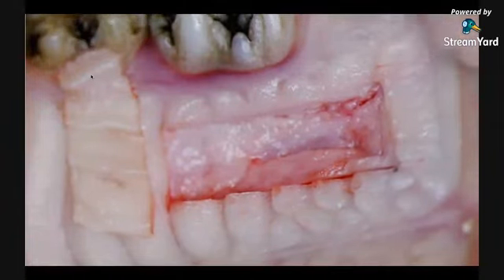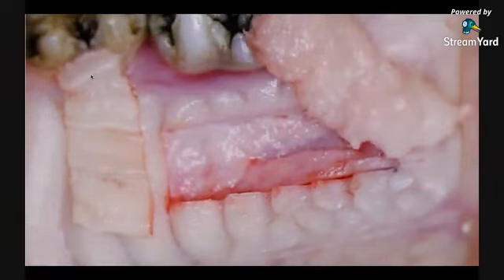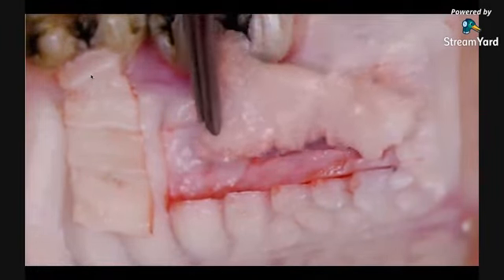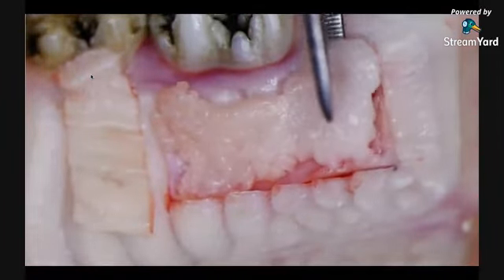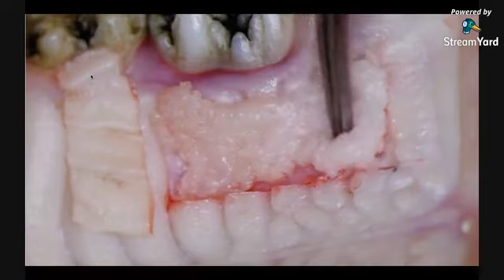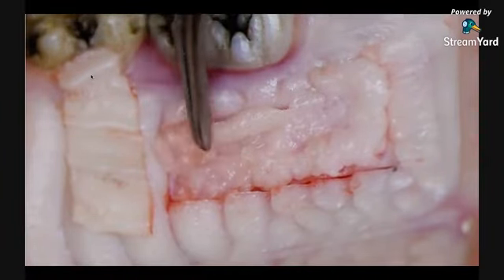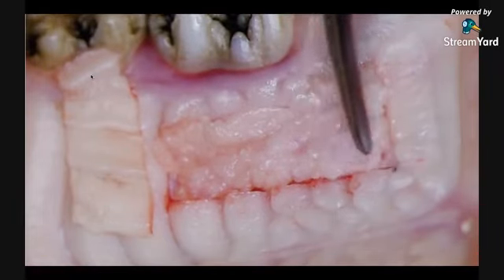And this is another way to manage when we take a free gingival graft. Imagine that this piece of fat from the pig is PRF. You can apply the PRF directly into the wound area. This will manage the hemostasis. You can have that benefit and it will boost the wound healing too.